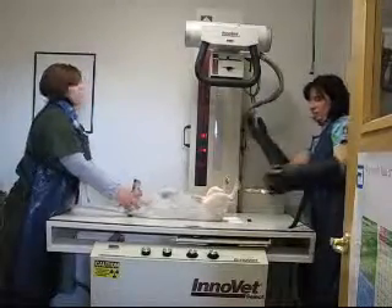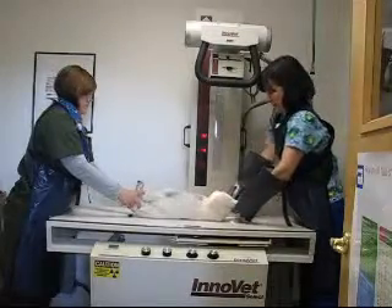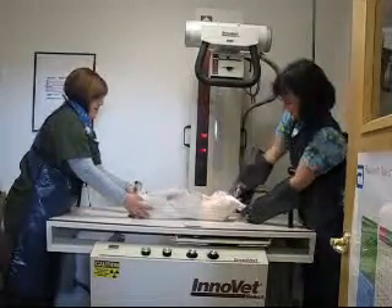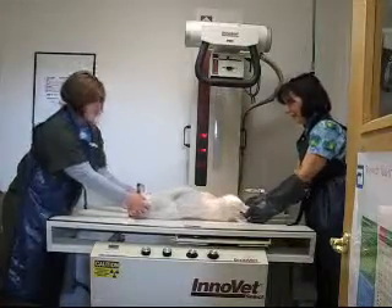We have a tray in. I'm going to grab her little feet, extend them and slightly rotate them in so they're nice and straight. Make sure her body's nice and straight, and then we'll take the picture.